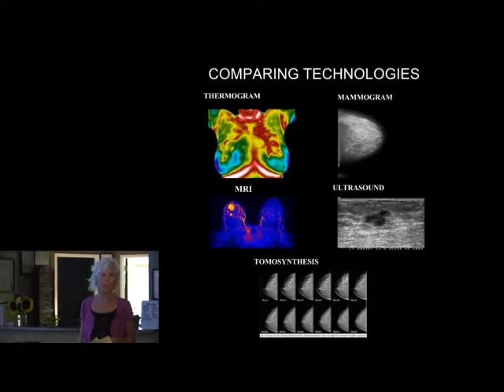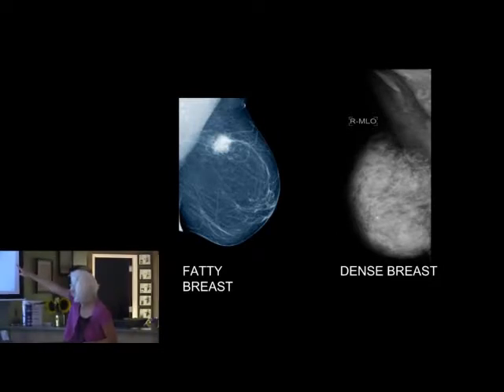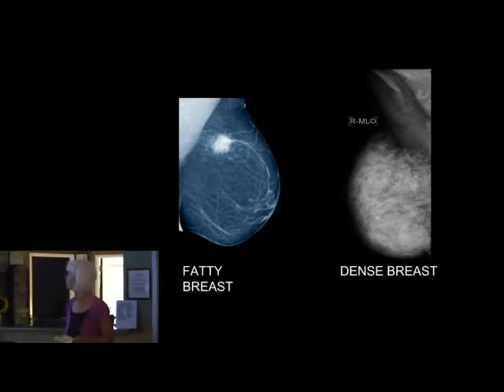This is a fact, and you probably do know this. If you don't, you need to know this. Mammography is a risk factor for the very disease it's trying to prevent because it's radiation. Next one, Effie. This is what a cyst, a lump in a fatty breast looks like, and this is dense breast tissue. So you can see that they can't read it. They can't see it. Clear in the fatty tissue.